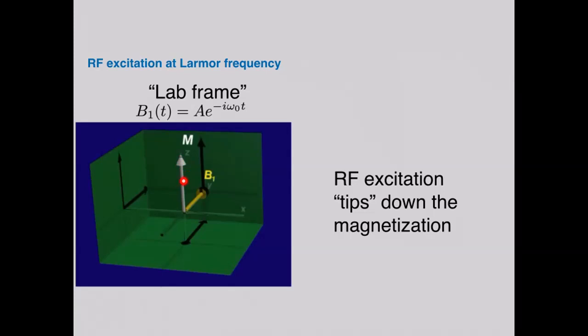At the same time, the B1 field, because it's also an RF field, will also rotate and always be at a very nice angle such that the contribution of its flip is going to add and add and add. I'll show you this illustration.